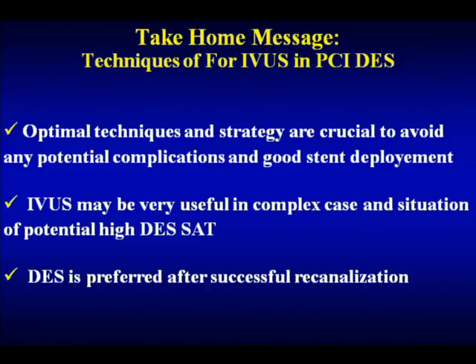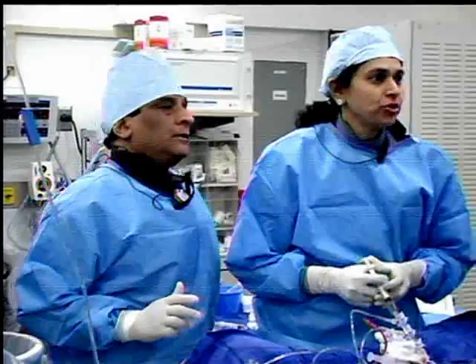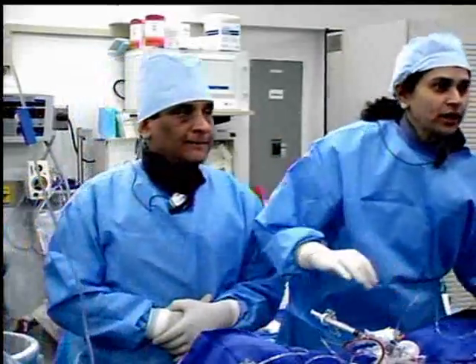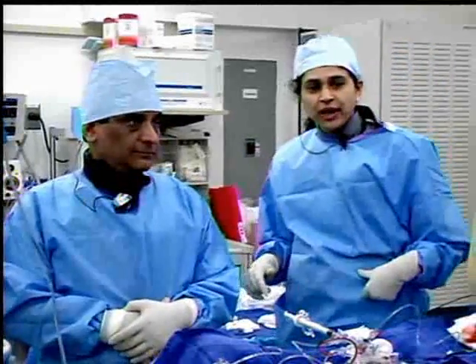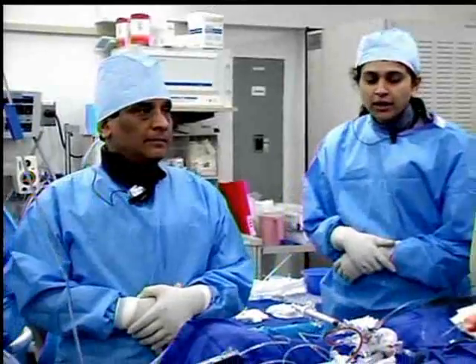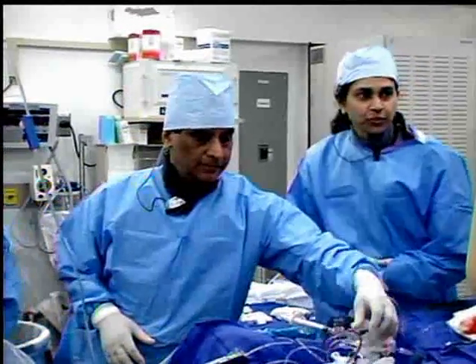And you want to just say something? We are done here. Yeah. I think one other point where IVUS is really necessary is in in-stent restenosis cases. If you have in-stent restenosis, it's very important to know the mechanism of restenosis, most important being whether it is intimal hyperplasia versus an underexpanded stent, where IVUS is a very important tool to make a decision how to treat that patient in that kind of situation.